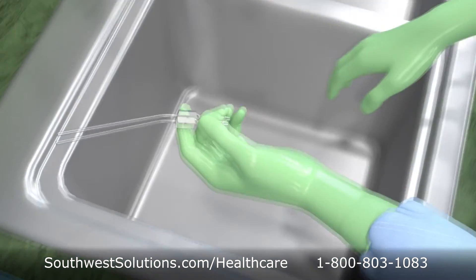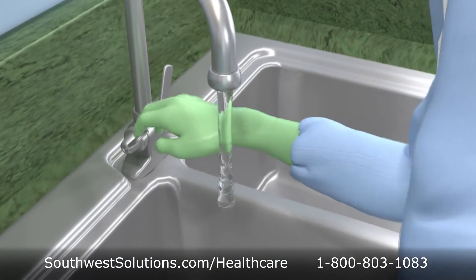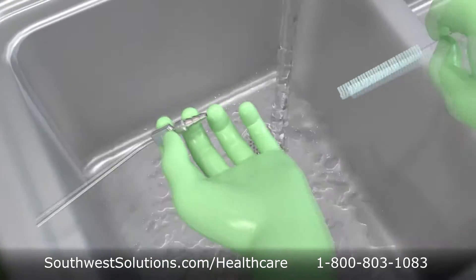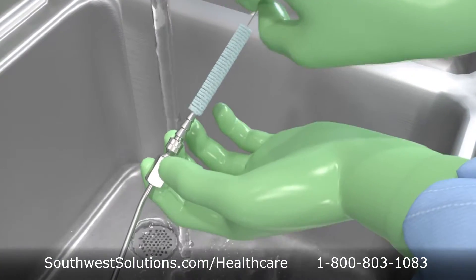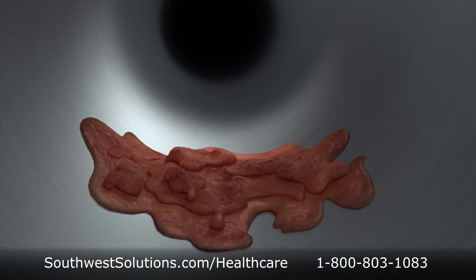Though it appears clean, this surgical instrument could be harboring bio-burden. Microbial contamination traps in interior spaces that is difficult to remove. This is especially the case with cannulated instruments or instruments with moving parts.